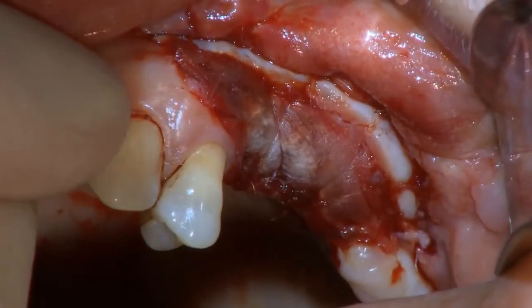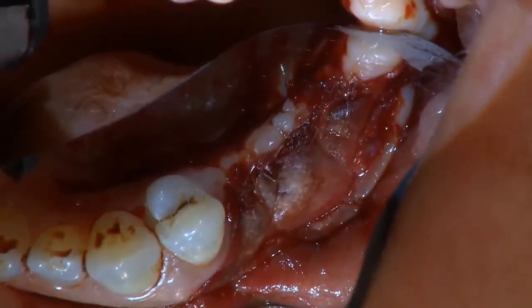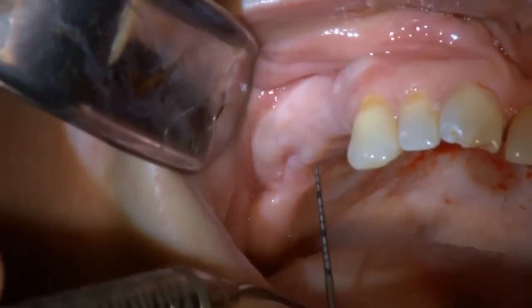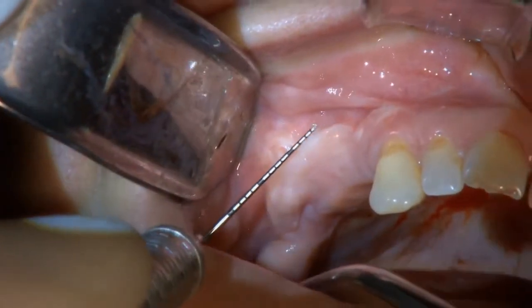As you can see here, everything is stable and well adapted to the bed of the host tissue. On the contralateral side, where we did the same surgery a few months ago, we now see a beautiful increase of the vestibule and the keratinized tissue.